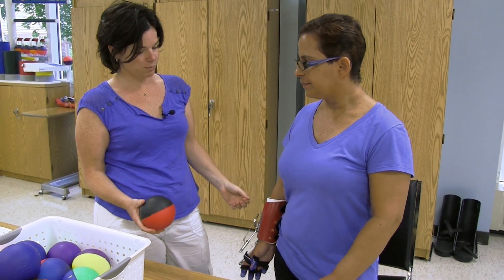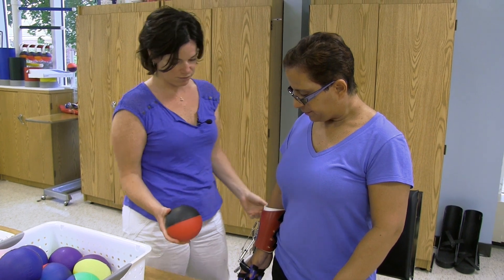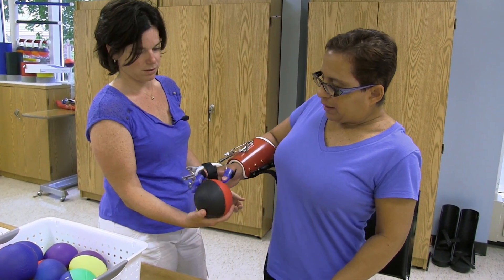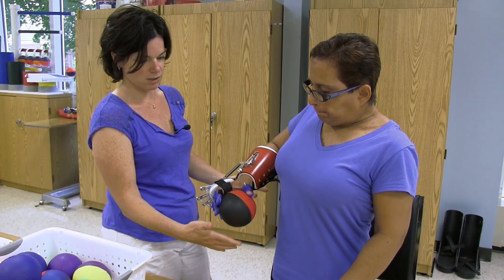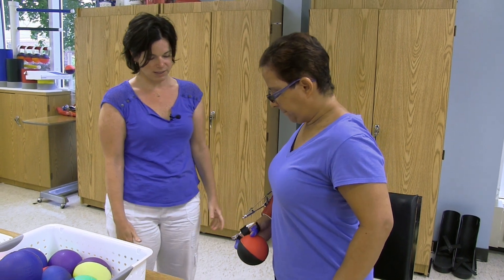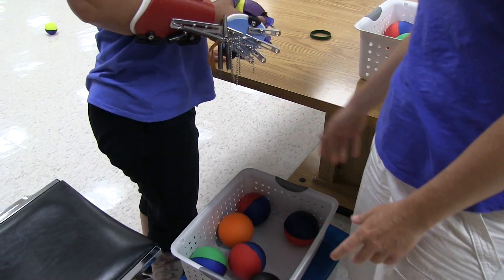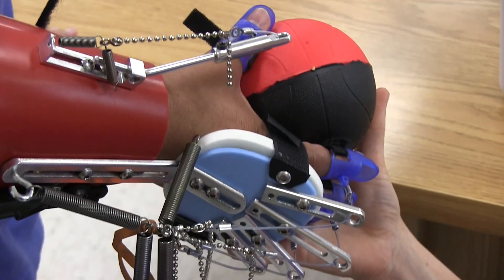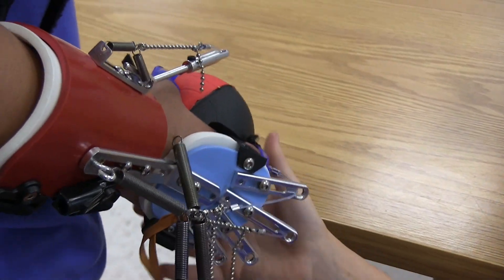If I can switch it out and bring my arms a little bit, it's more complex because she has to deal with her dynamic standing balance as well as reaching. Reach forward and squeeze it — squeeze, squeeze. Drop it down and release. Bring it down and squeeze it. There you go, good.